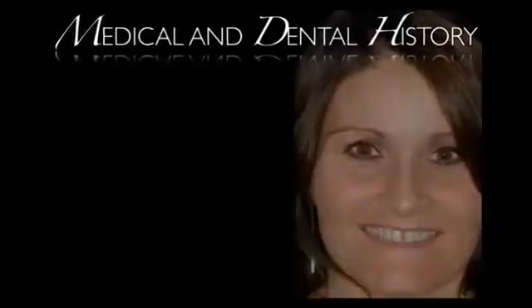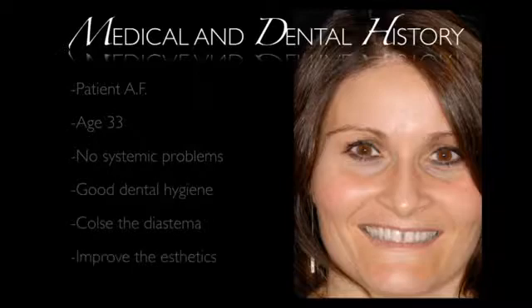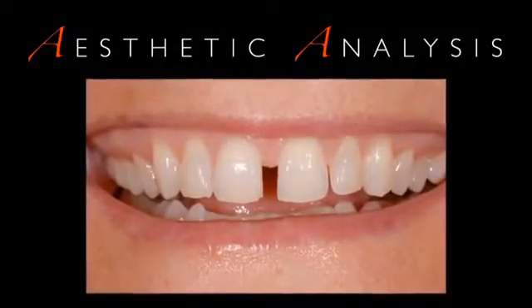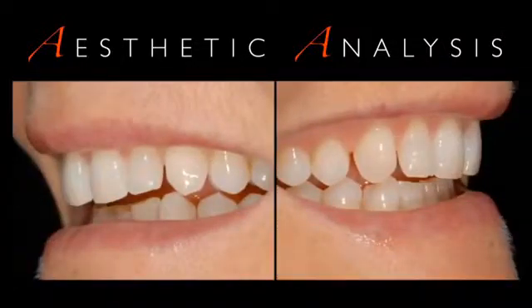The first step to do is an aesthetic analysis with a data collection. This data will be provided to the technician in order to create a precise workup with all the modifications able to improve the aesthetic of the smile.